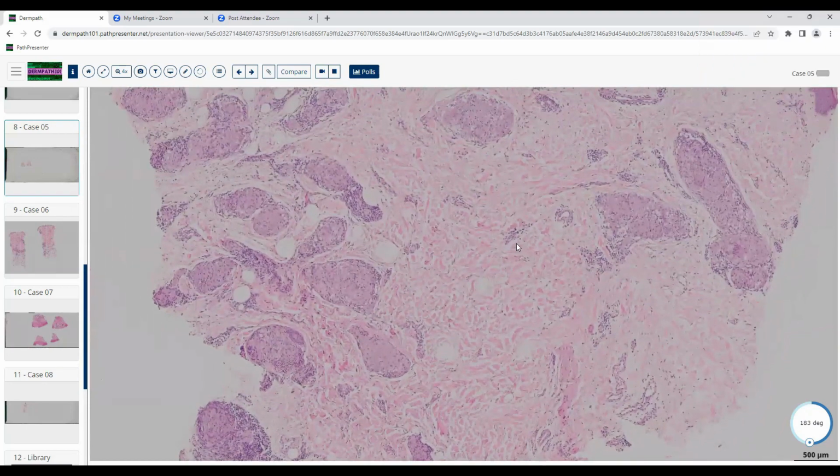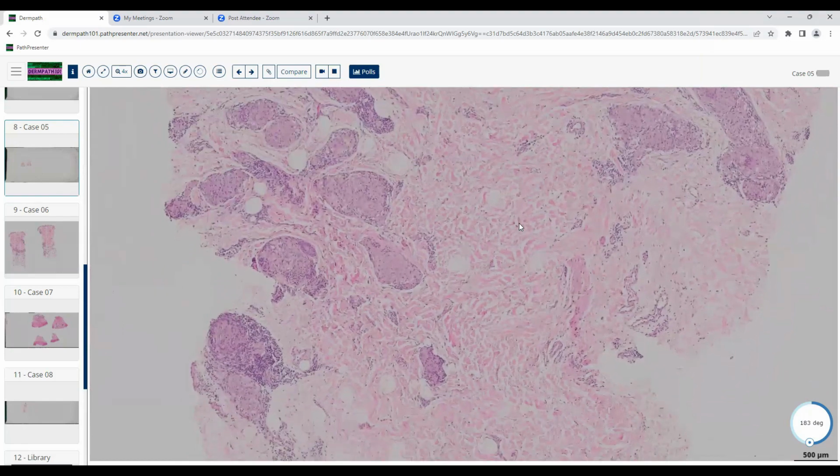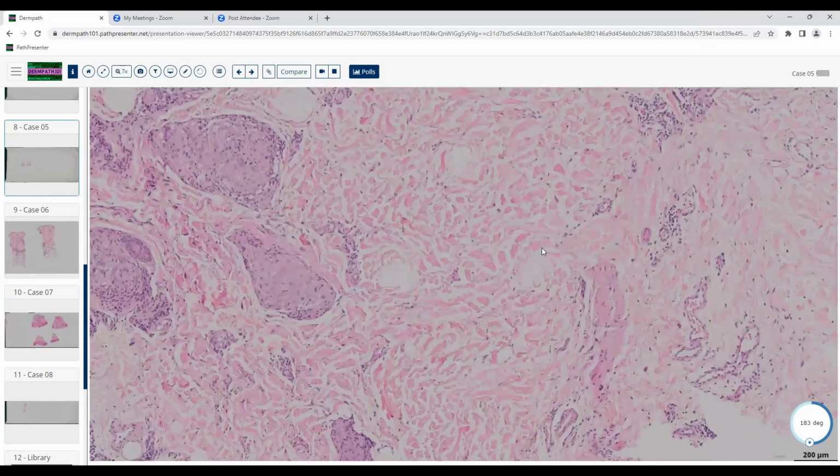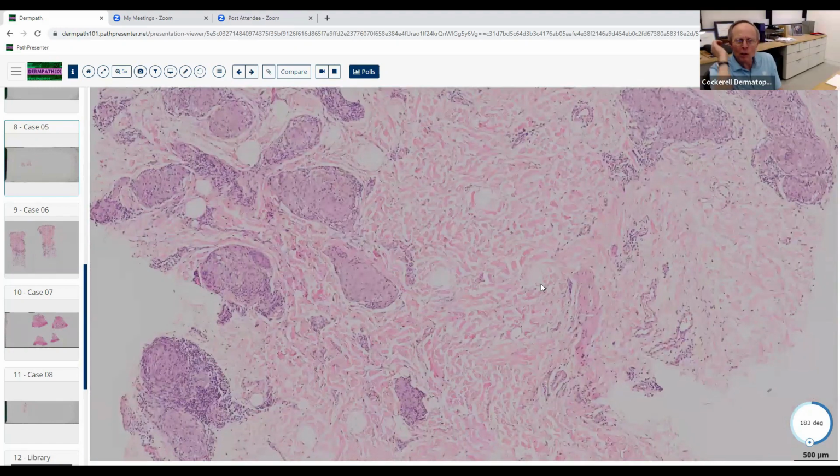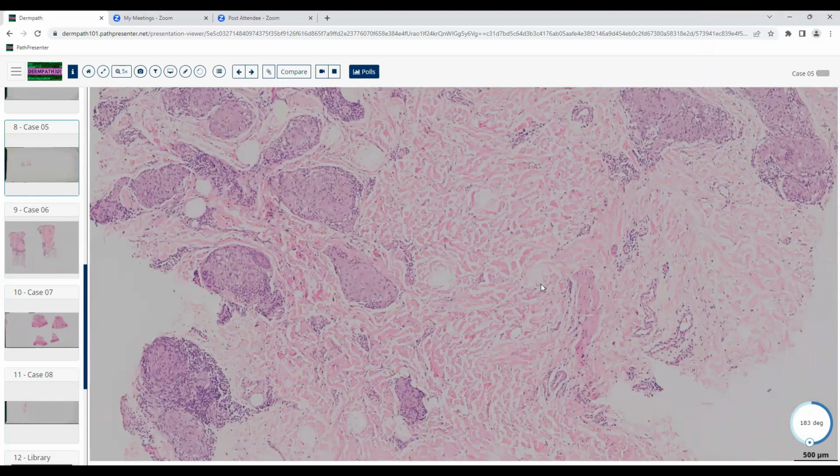I guess you would expect to see maybe the globi, the bacteria. We don't see globi in the tuberculoid form. So if this was the tuberculoid form, we wouldn't expect to see that. That's really seen only in the lepromatous form. But there's a couple of clues.